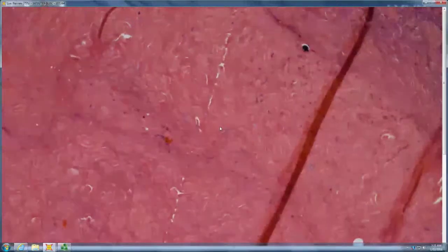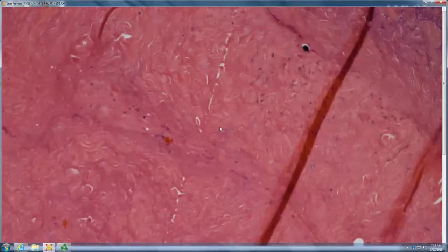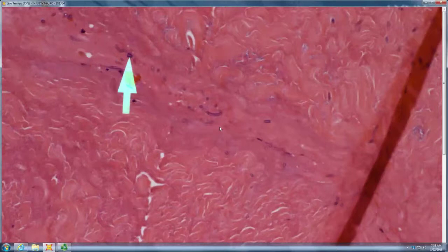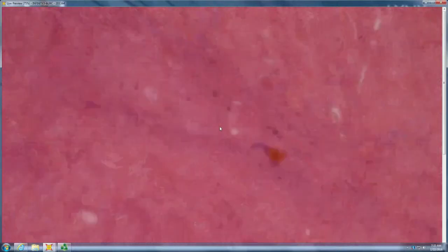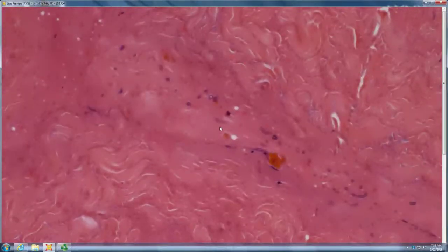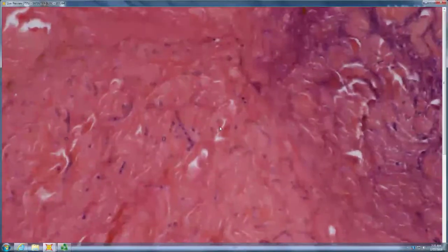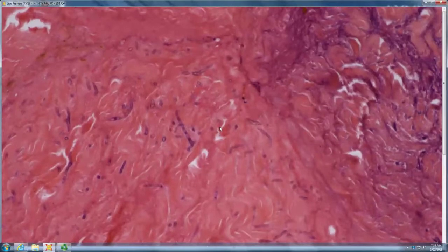Okay, so if that's a vessel, Caitlin, right here, you got a couple of things going on, right? It looks like it's mostly occluded with hyphal elements. So I'm wondering if this is hyalohyphomycosis, such as Aspergillus or Fusarium. Yeah, they're about that size, right? And they don't have a lot of visible cell wall, so that would be a reasonable thought.